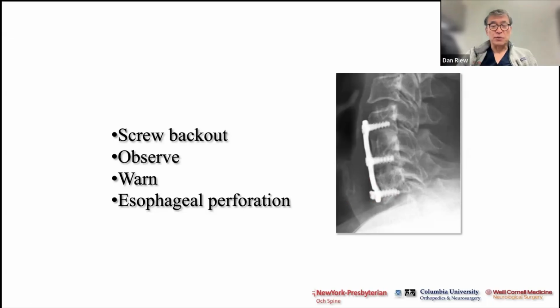There's even one case report of a patient who had a non-union, who had a plate with 4 screws in it, a one-level plate. And then the next x-ray shows the plate is gone, and the surgeon says, when did you have surgery to remove the plate? And the patient said, I never had surgery. And he goes, no, come on. The plate used to be there. It's not there anymore. The patient says, I never had surgery. And so they wrote it up as a case report where the entire plate and 4 screws extruded through the esophagus, went down the alimentary canal and out into the toilet. Patient never realized it. So that can happen.